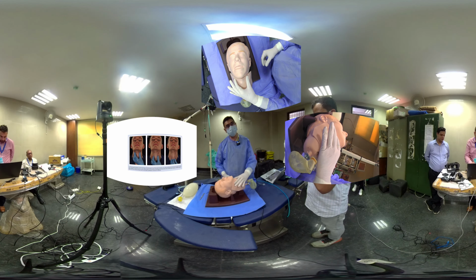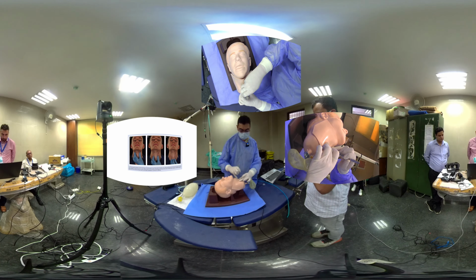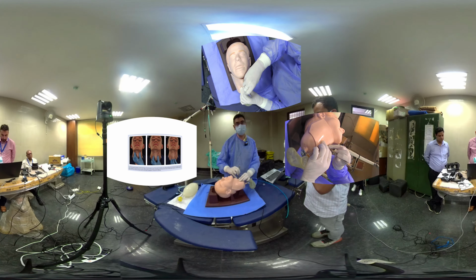Once you identify the cricothyroid membrane, you hold your scalpel in your dominant hand, that is the right hand, and at the space where you find the cricothyroid membrane, you have to put a stab. Once the stab is given, you just twist it by 90 degrees. This will make a wide opening in the cricothyroid membrane, and then you retract the blade towards your side. Once you retract the blade, you need to change your hands. You hold the scalpel with your index finger, and with your right hand you make sure that the scalpel is straight and not tilted, and then you insert the bougie through that space.